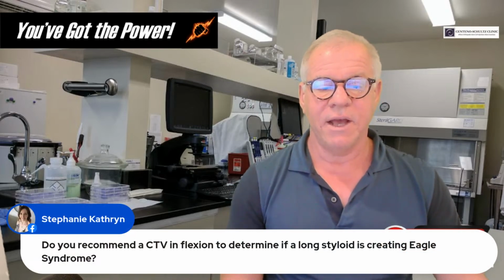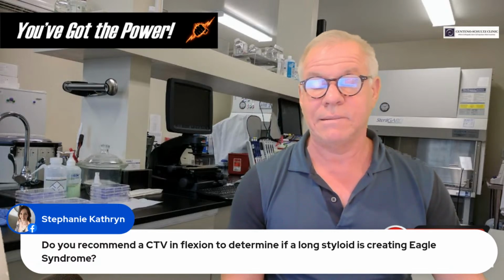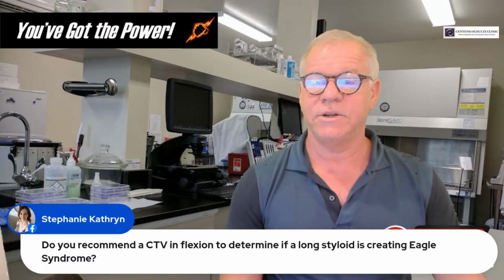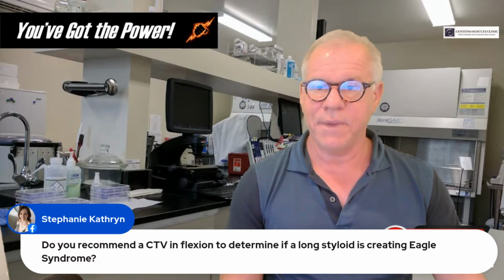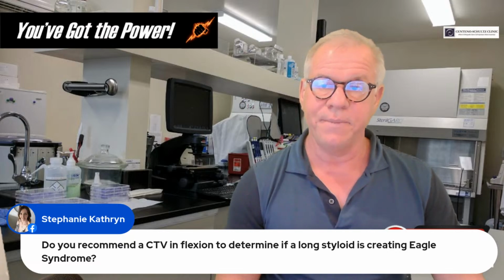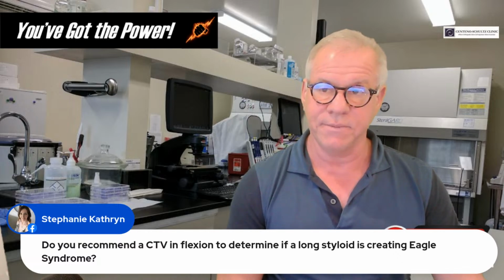Stephanie, do you recommend a CTV in flexion to determine if a long styloid is creating Eagle syndrome? No, simply because we've got very little data on what should happen to the internal jugular vein in flexion on a CTV. I think I've talked about this quite a bit now, and that is that compression of the internal jugular vein is a common problem in patients without symptoms.